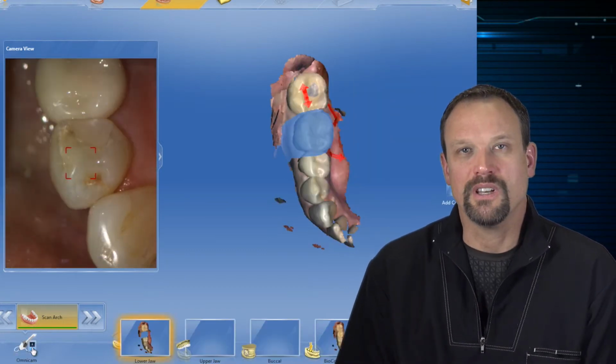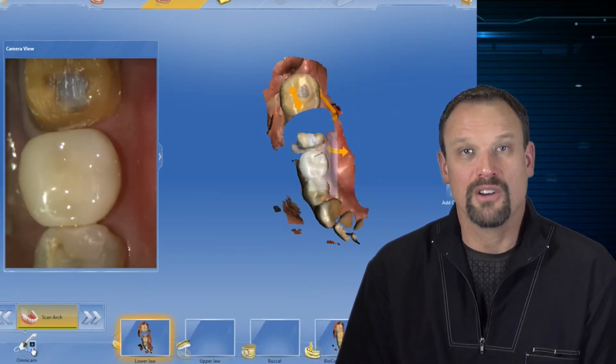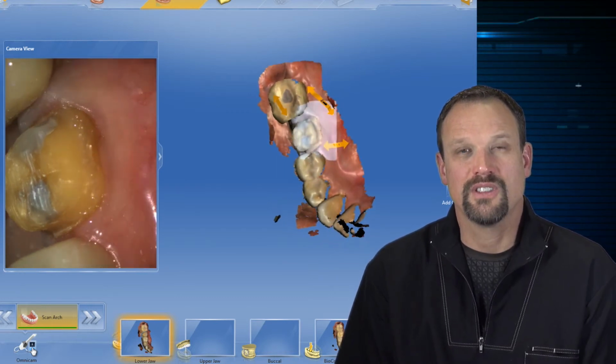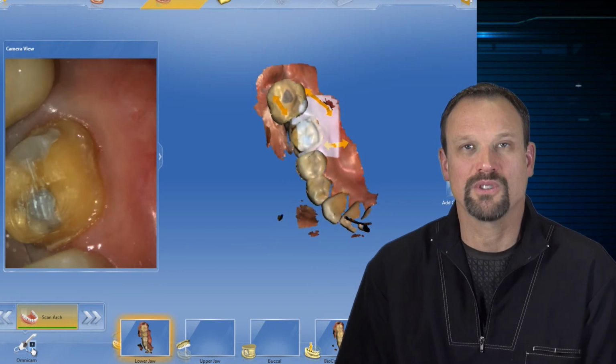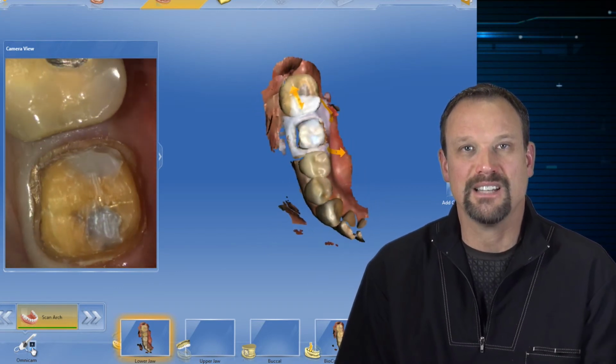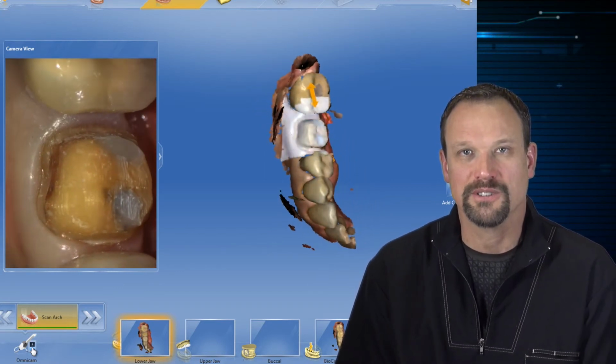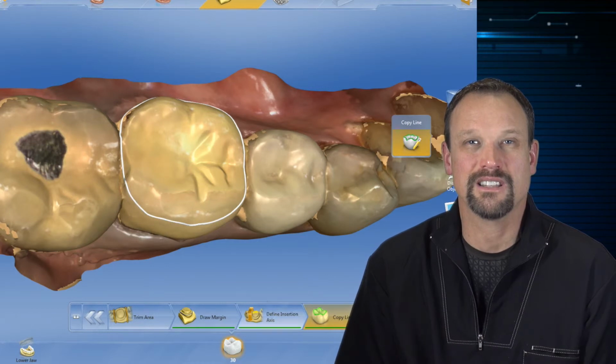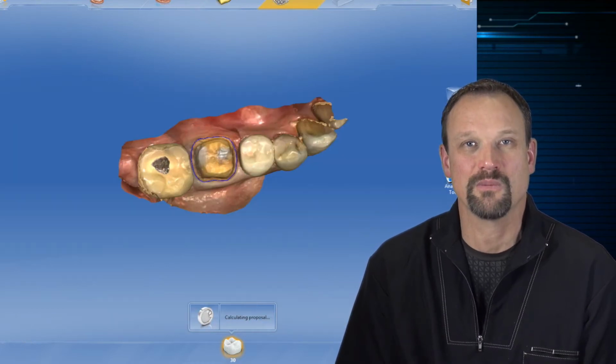One thing you'll notice when we're doing the final model is that it just has to fill in that one tooth. So this particular amount of time that we're spending to do this is the net amount of time for the final impression. So now we have a preoperative model and a prep model that are completely the same, except the difference is tooth number 30.